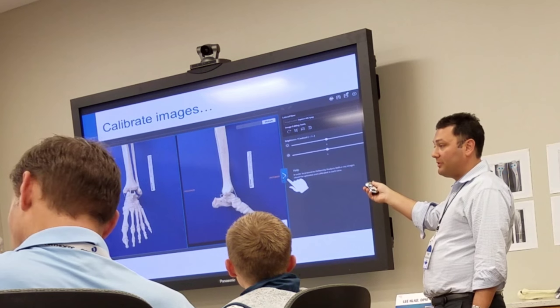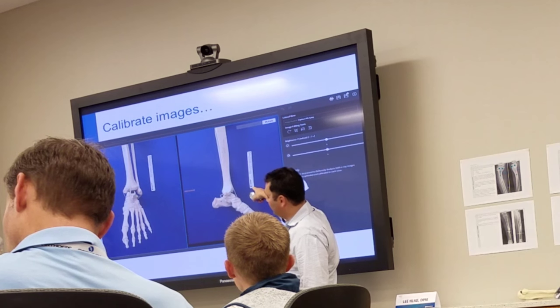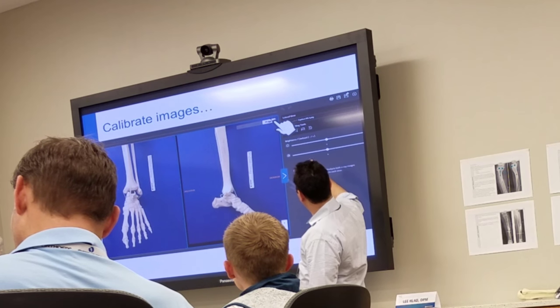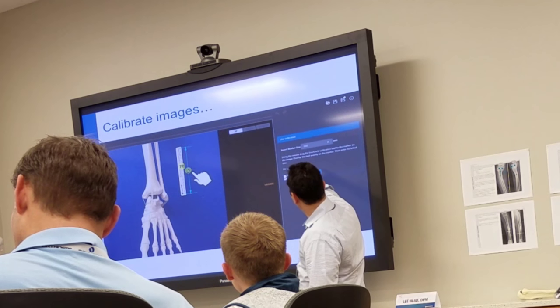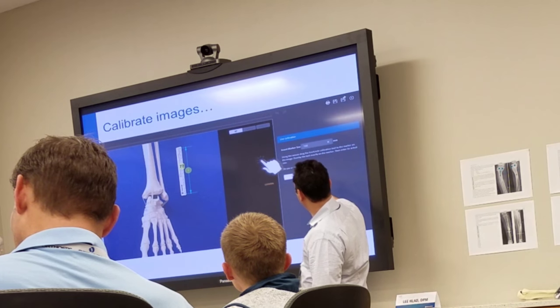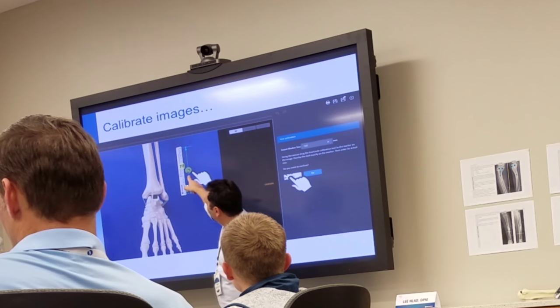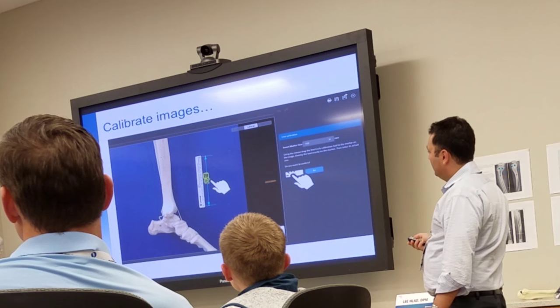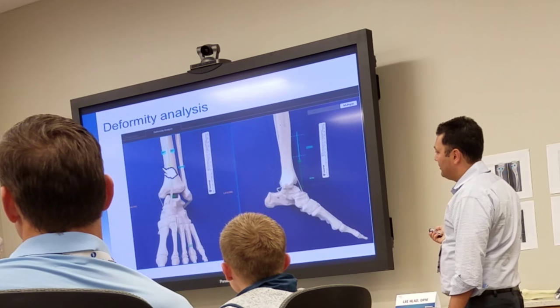You can take a little ruler and tell the computer — because it asks you — do you want to use a line or a circle? You can use the line, calibrated so that it's ten millimeters when you take that picture. Confirm what you marked. You can do 20 millimeters, whatever you want, but you just have to make sure it's calibrated properly.